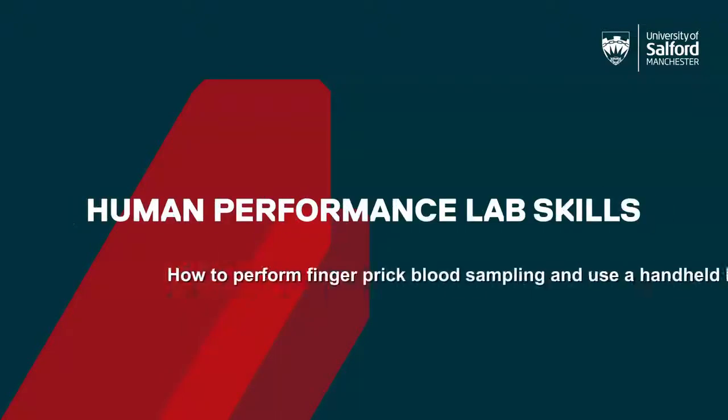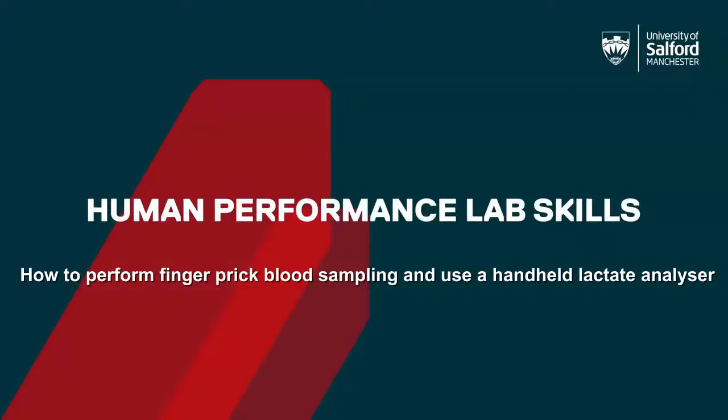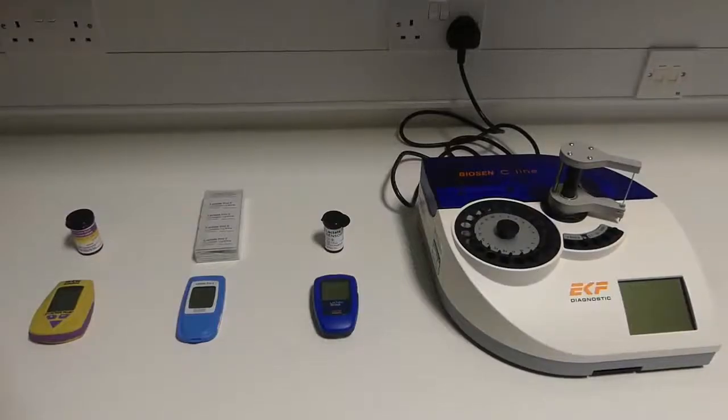In this video we will look at how to perform finger prick blood sampling. In the exercise physiology lab we use finger prick blood sampling to get a small blood sample for a range of testing.